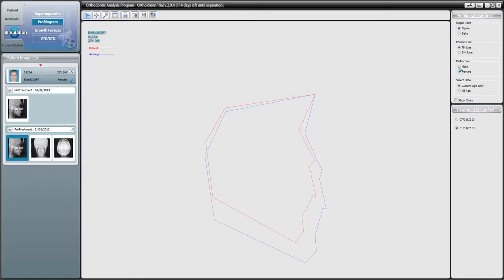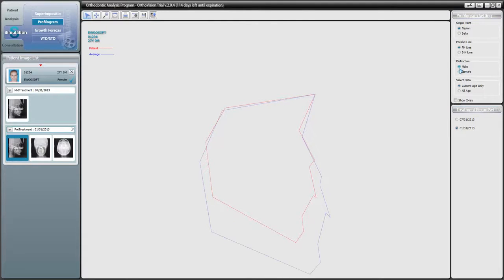Before beginning to analyze this profilogram, make sure you have the correct gender selected under Distinction. As you can see, when you select Male, the average profilogram size increases.